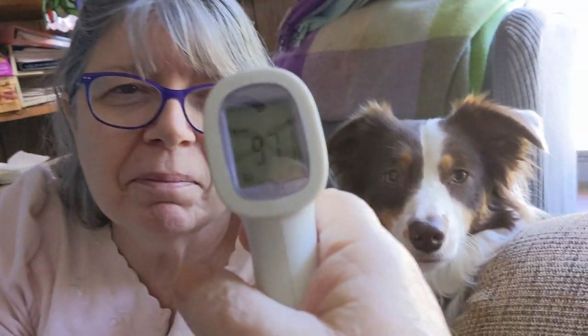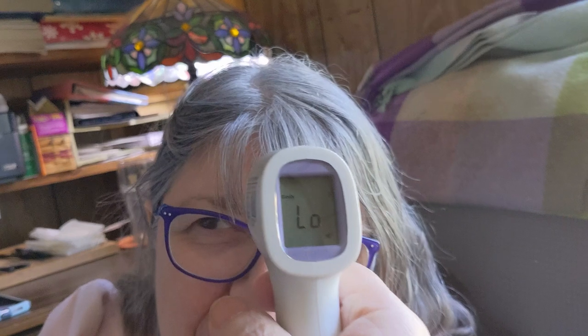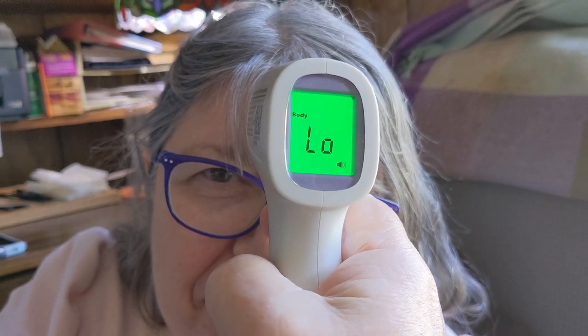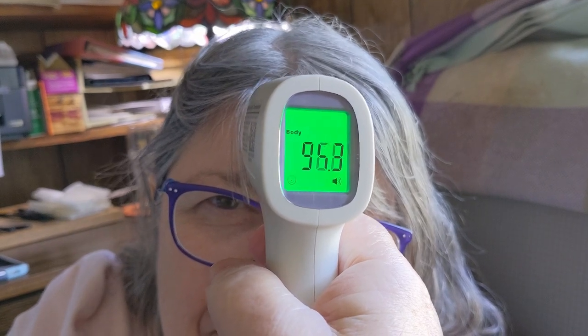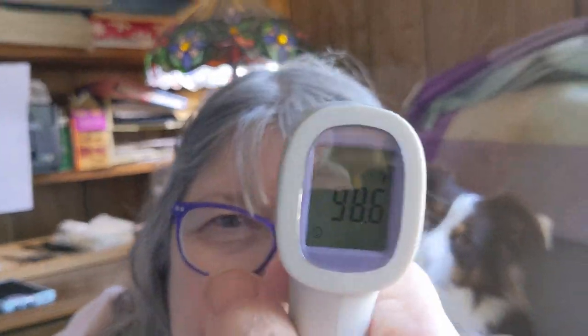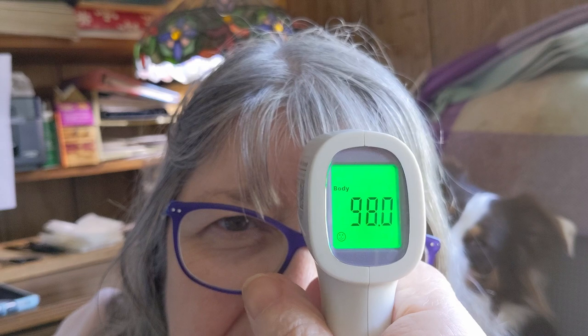She has 97.1 — so that doesn't look too bad. Let's try Lacey. She was low and she hid — she goes, "I don't want my temperature taken." Let's take Sue's one more time to double check. I'm going to get pretty close but I don't have to touch her — about an inch or two away. Now it says 94. I don't believe that's right. We're going to try again. I'm going to get fairly close, about an inch. It says she's 98. I'm going to hit it one more time. There — it says 96.7.